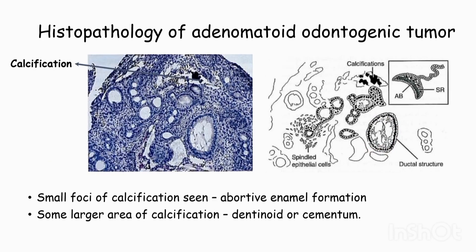Small foci of calcification are seen, which is due to abortive enamel formation. In some lesions there are larger areas of calcification, which is due to dentinoid or cementum.